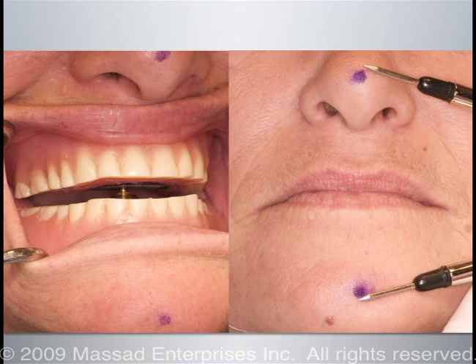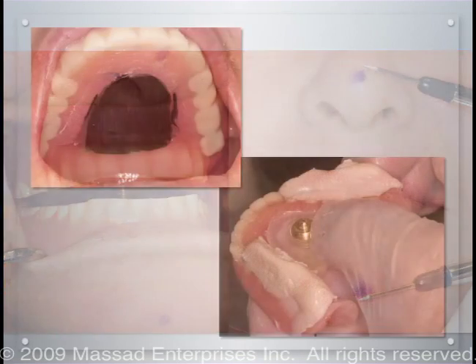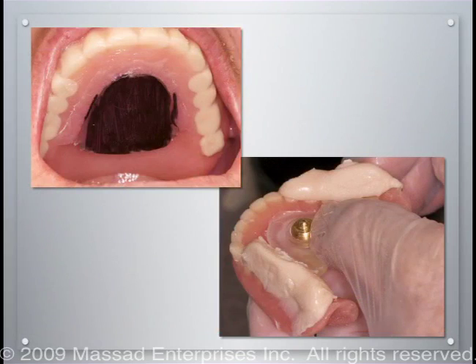The pen, when it strikes the maxillary striking plate, holds the maxillary denture in position and the mandibular denture secure to eliminate rocking of the prosthesis during the fabrication of the occlusal splint. It is suggested that the maxillary striking plate be coated with an ink solution so the practitioner can observe all of the movements while the patient is moving their jaw in different positions.